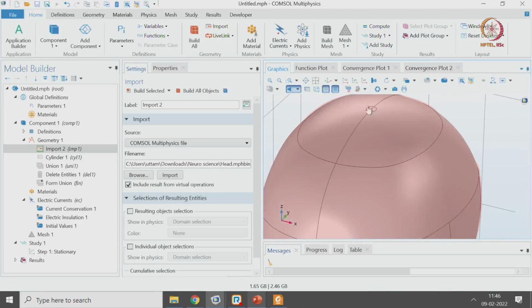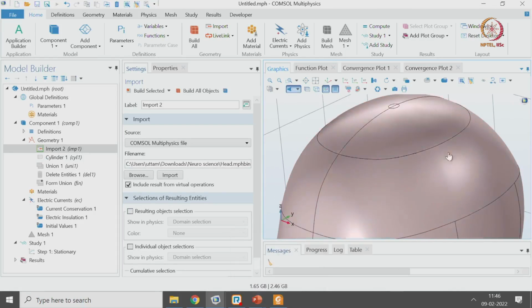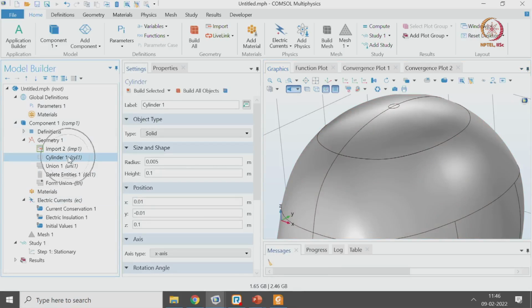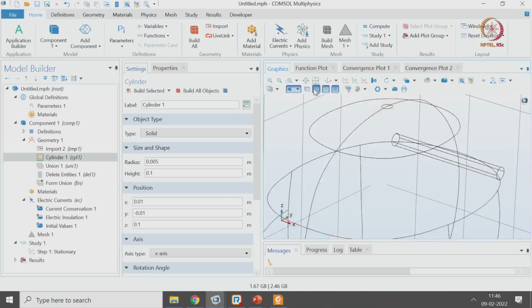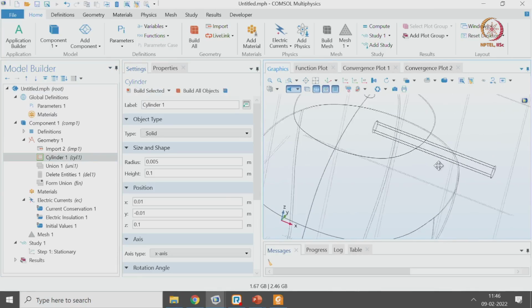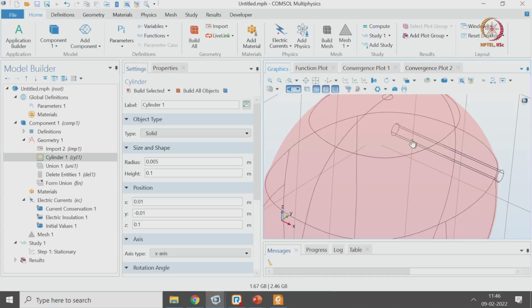So I don't need to add the surface for the ground, but I want to have one more stimulation somewhere over here. To do that, I can just use the cylinder, for example. I will just place the cylinder over here. There is also an option of wireframe rendering. You can see that it's a very elongated cylinder which passes through the tissue, but I am interested only to have the intersection of this long cylinder with this tissue.